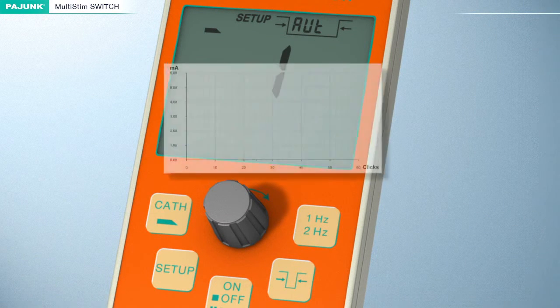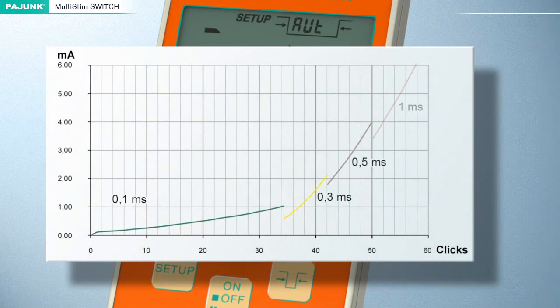In the automatic mode, the pulse width depends on the pulse current and has, on the basis of the Choquet-Feugeat table, been stored permanently in the nerve stimulator. The intention of this method is to achieve a fast, efficient approach to the nerve on the basis of a constant charge.